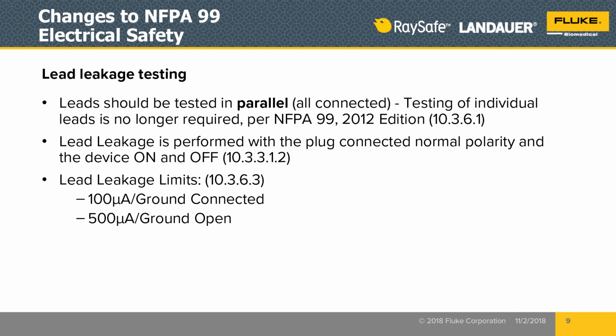And that is okay. You'll also note that in a number of these slides, there are repeated points that your device under test needs to be tested with it both on and off. That's of course most common with something that's a physical hard switch, but you can also have medical equipment now with soft power on/off buttons where there's still electricity in the chassis. It's just the medical device hasn't fully started up. So it's good to note that you still do have to test in both conditions for power. And then the lead leakage limits have basically stayed the same. It's just now you can look at them as the total leakage current, with 100 microamps for the ground connected and 500 microamps for the ground being opened.